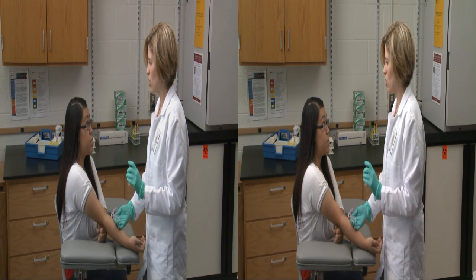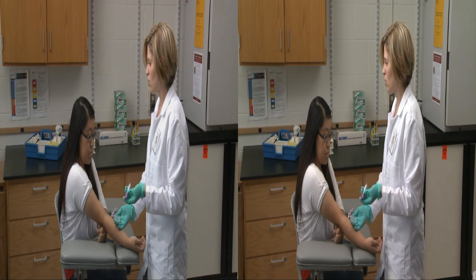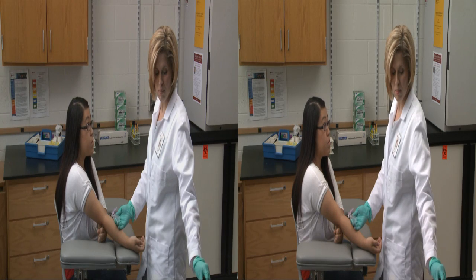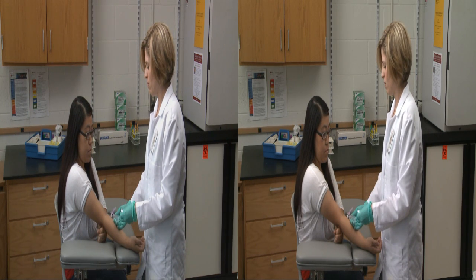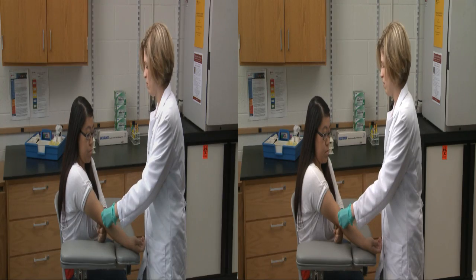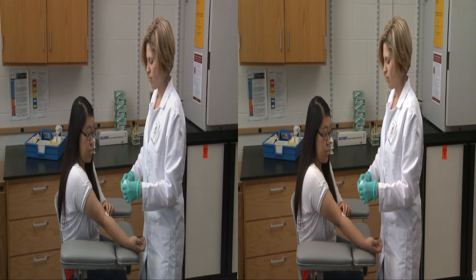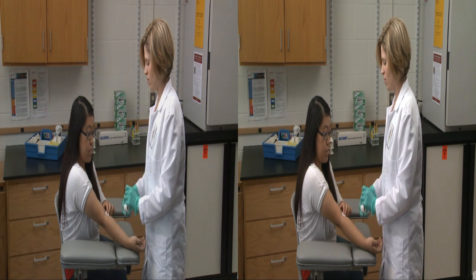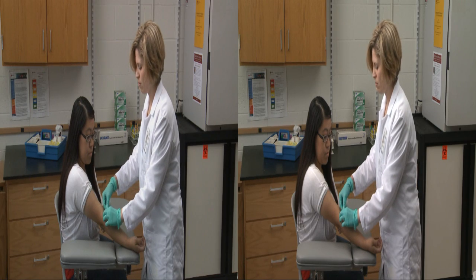My responsibility is to assure the quality of the samples I draw so that the results your doctor receives are both accurate and meaningful. The level of quality and integrity of the samples the laboratory receives is dependent upon the level of skill, knowledge, and professionalism of the phlebotomist. A big responsibility, but one that can make a real difference in the lives of your patients.